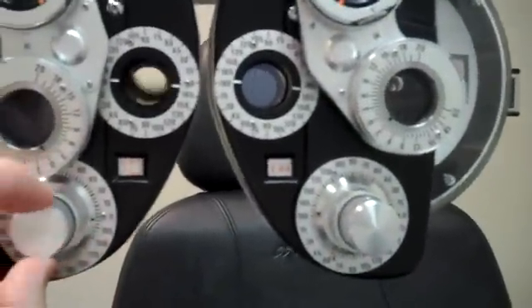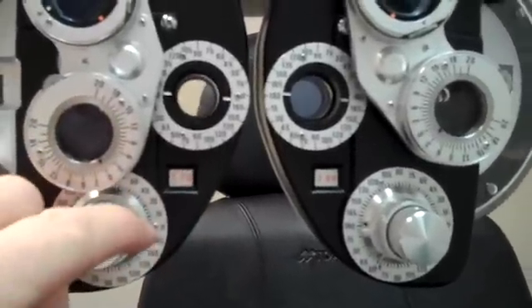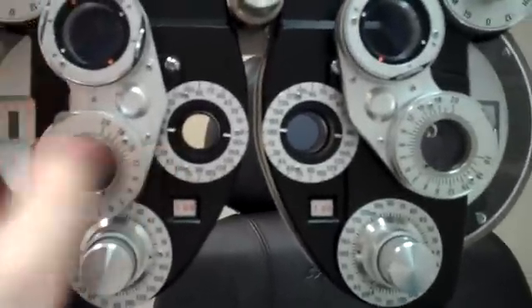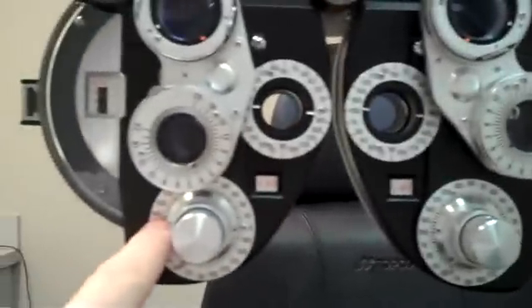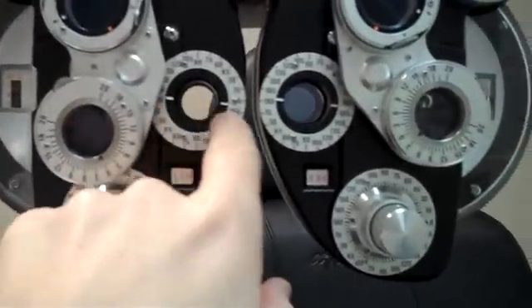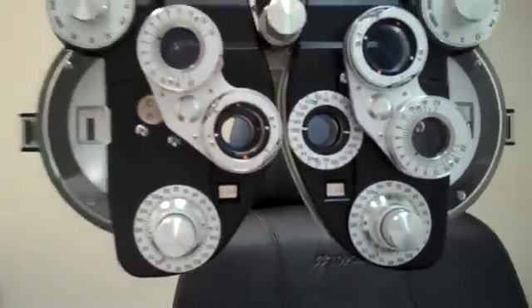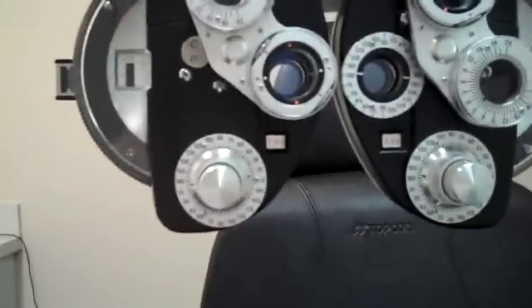Let's say you've got a little bit of astigmatism — maybe one unit. This is telling me how much power the astigmatism is in this lens. Astigmatism has a power, but it also has an angle. You notice these little arrows here — there's the little angle.